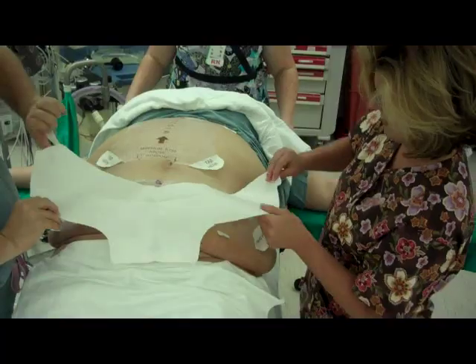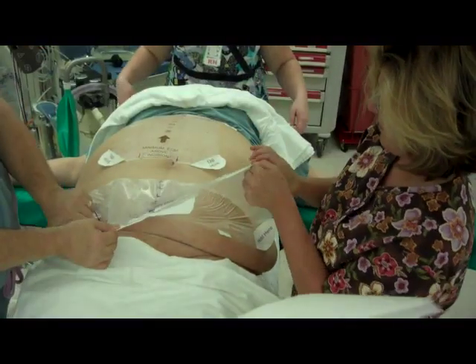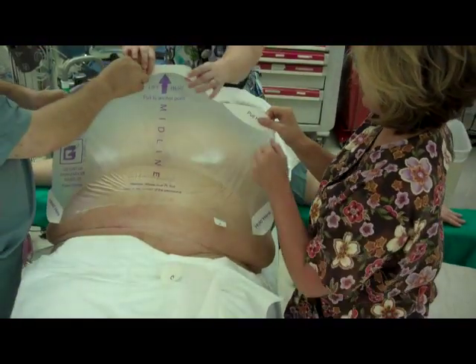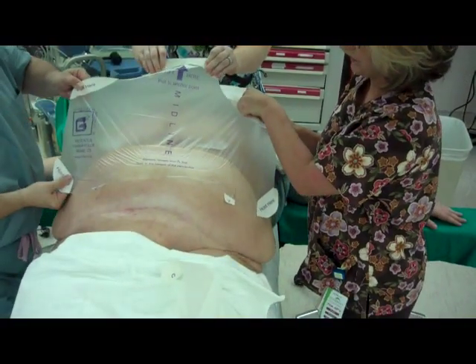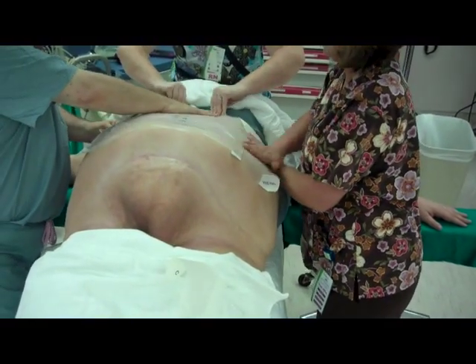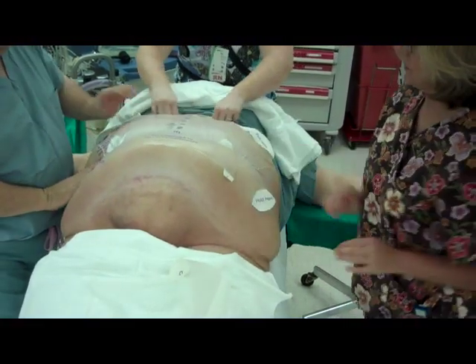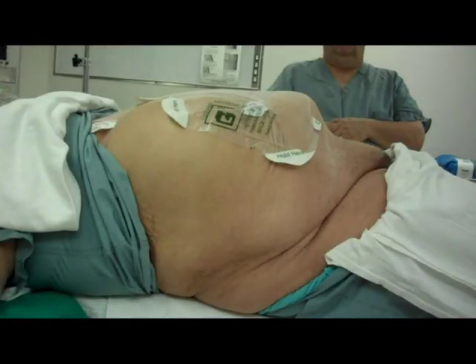The person at the head of the patient holds the top of the device while the scrub and surgeon each grasp a hold tab. Together, they pull and stretch the device to affix to the extender and smooth down over the patient's skin. It just took about two minutes to achieve optimal retraction on a very large BMI patient that maintains the integrity of the sterile field.